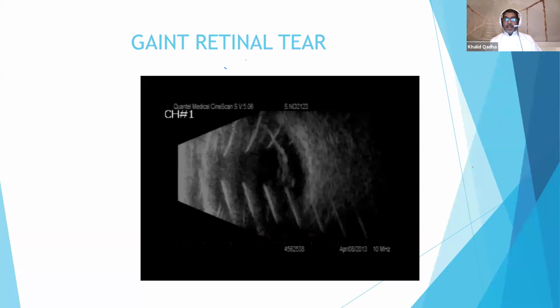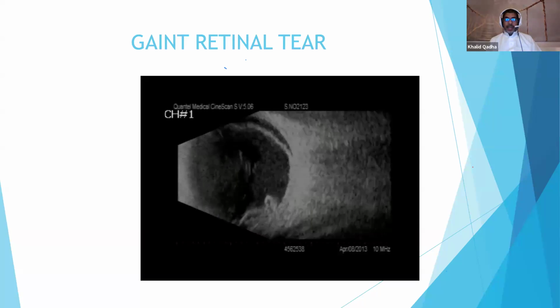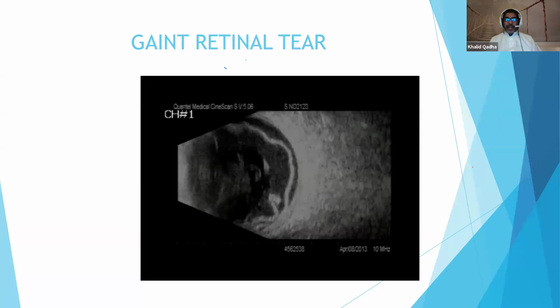This is a video of a giant retinal tear. It was a 180, sorry, 180 degree cut from the superior part.